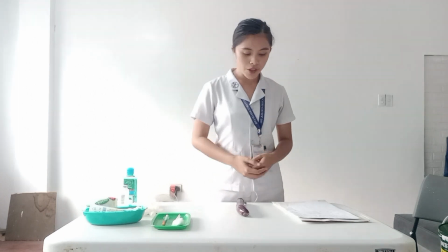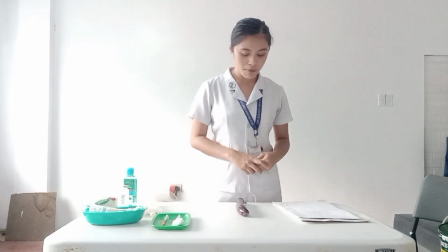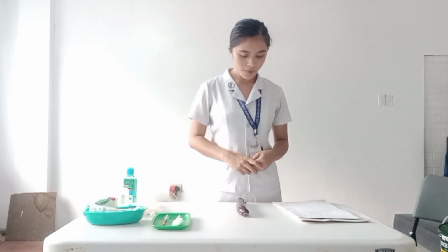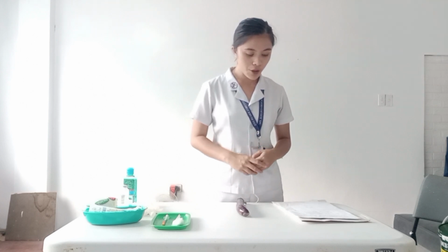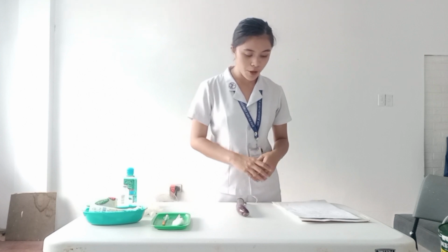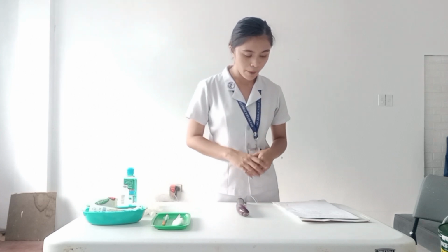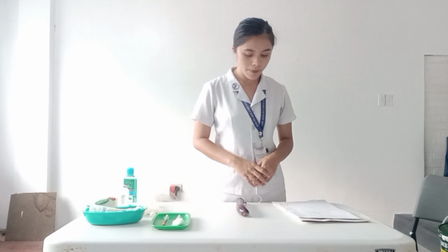Good day, ma'am. I am Jasmine Sadanio and I will be your student nurse for today. Kindly state your name and birthday, please. Thank you. So, ma'am, I am here to administer your insulin, which will help your body control your blood sugar for your type 1 diabetes. I will be injecting the insulin on your abdomen. Will that be alright with you, ma'am?